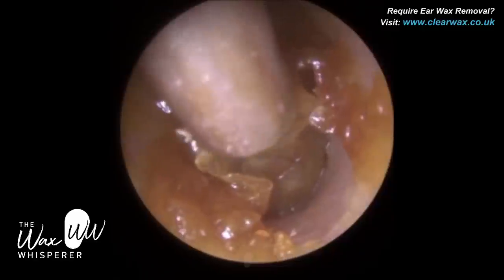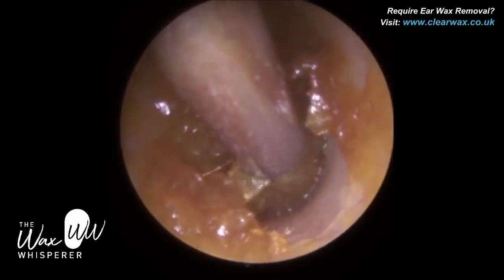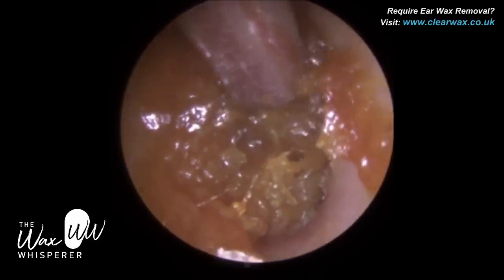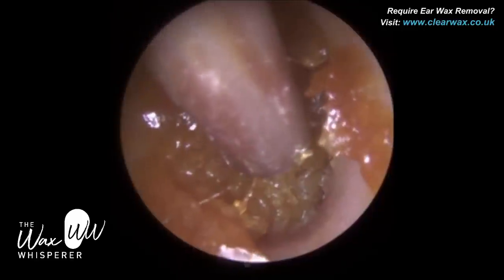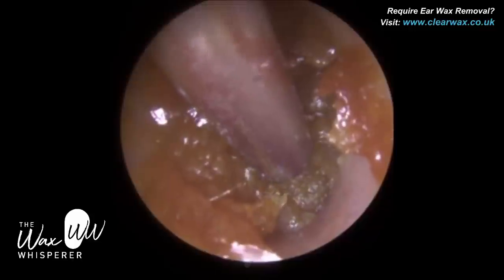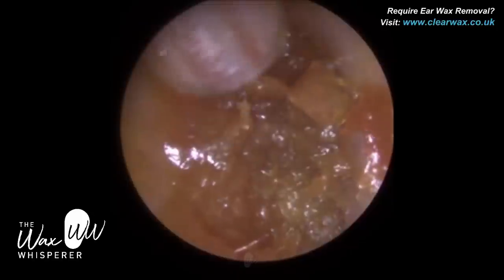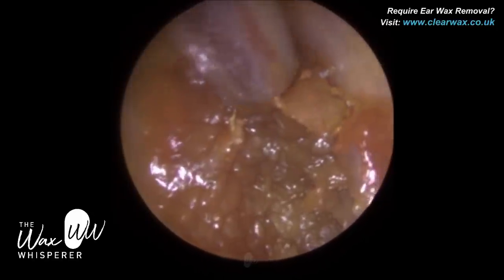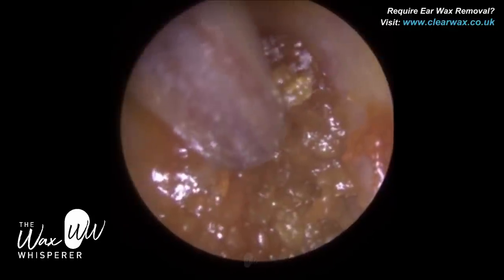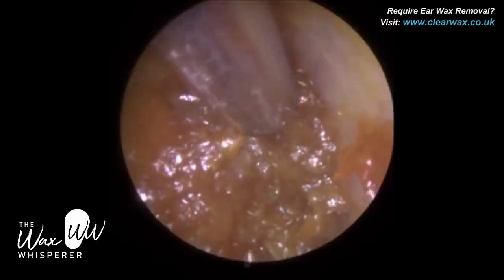This particular video illustrates the clear advantages and benefits of using an endoscopic approach to removing earwax. With the endoscope, you can just see the wide field of view — we've got the entire ear canal in view. With all other visualisation techniques, so if you're using a microscope or head loops, an otoscopic approach — first of all, there's a speculum inserted into the ear. A speculum is like an ear funnel attached to the end of an ear scope.